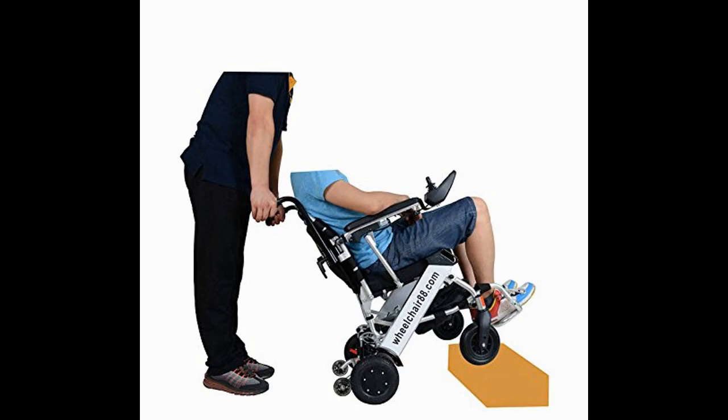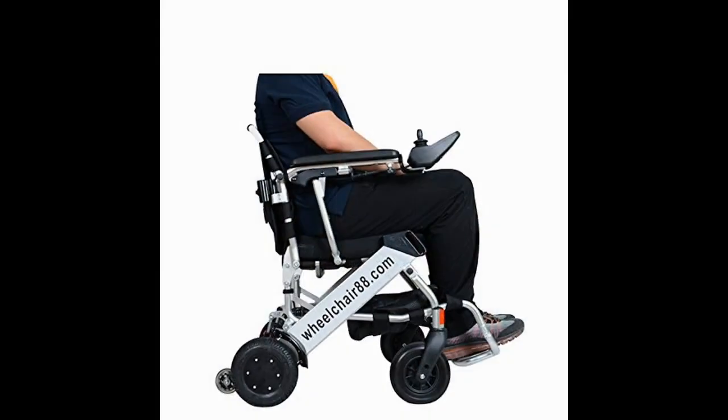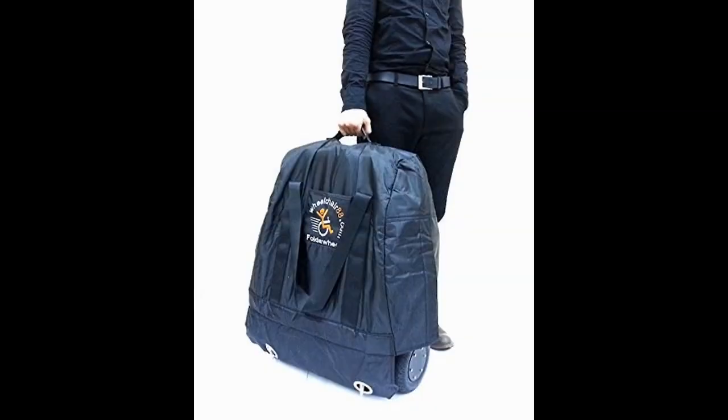Hi. I bought this chair for my wife. Most electric wheelchairs are big, bulky and heavy, and unless you have a vehicle large enough for one, or a trailer hitch and platform designed to carry one, traveling with one of those other chairs is a big hassle — so much so that my wife was resigned to being pushed in her regular chair whenever we went out.